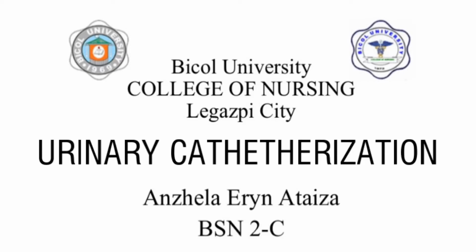Good day, so I will be performing urinary catheterization. This is Anzhela Eryn Ataiza of BSN 2C.